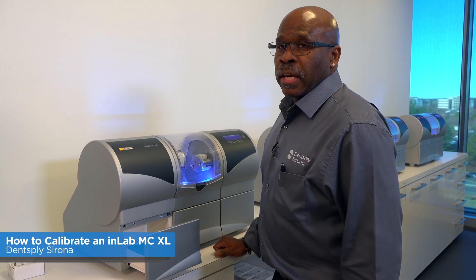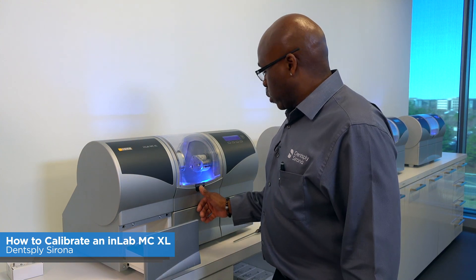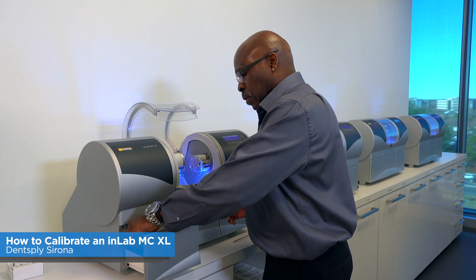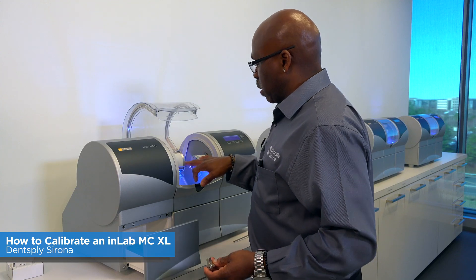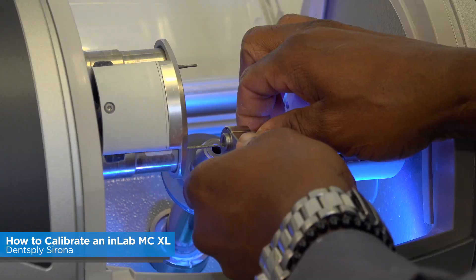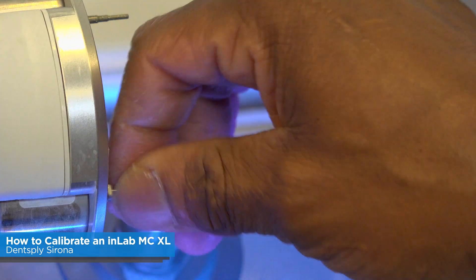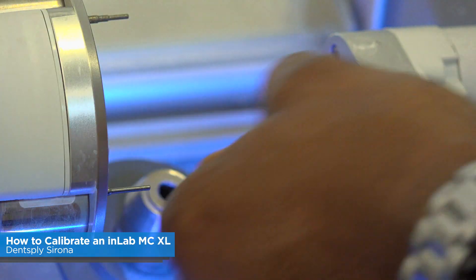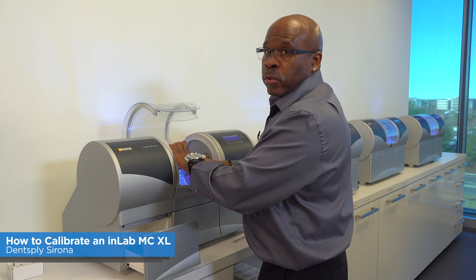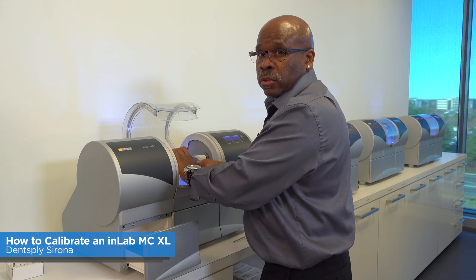At this point, we're going to put the calibration pins in and set this machine up for calibration. Open up the chamber door and use your torque removal tool. Motor set number one is now in position — remove the burs and put the calibration pins in. When tightening the calibration pins, make sure they are torqued — you should hear at least one click.